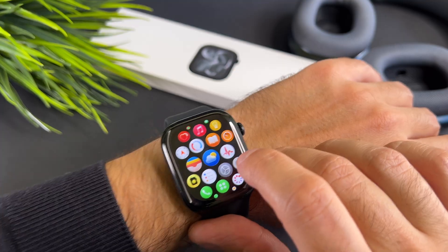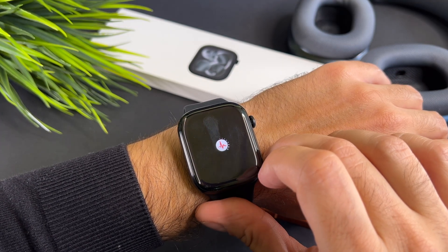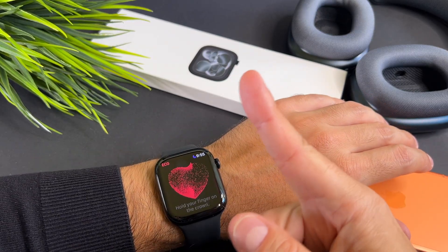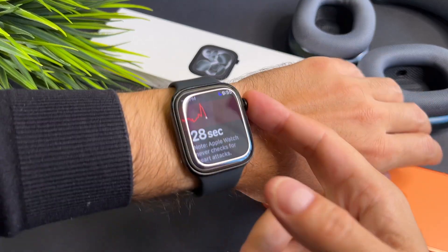Now open the app. To use it and start the process, you need to hold your finger on the digital crown. Don't press the button, just put your finger on it gently.